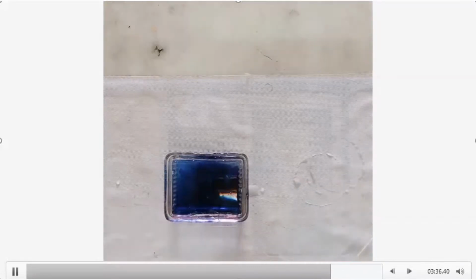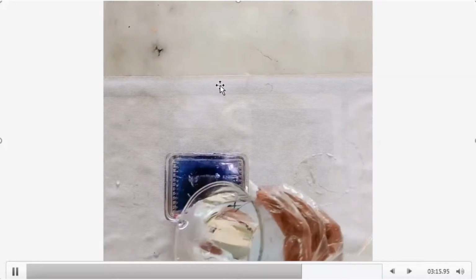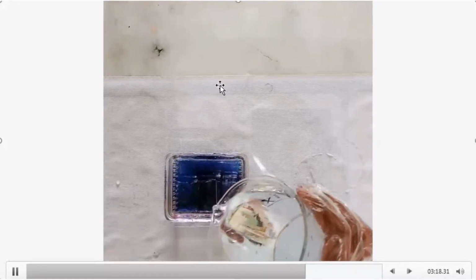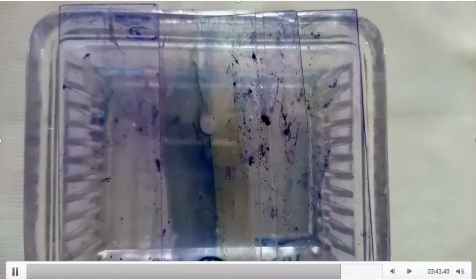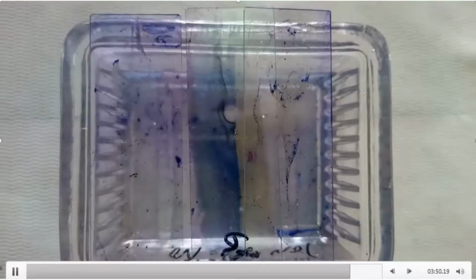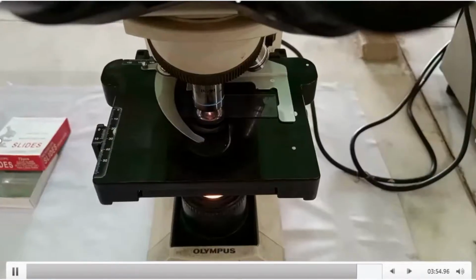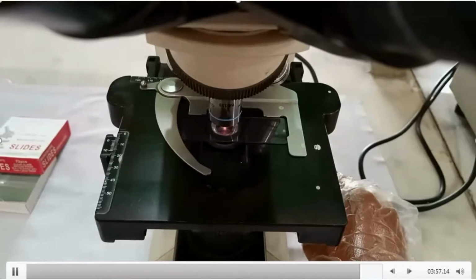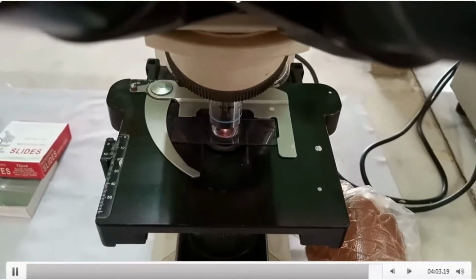Now we are going to wash them under the tap also. After washing, we are going to keep them in a vertical manner in order to dry them. And now we can see these slides left for drying. Now we are going to see them under the microscope under the oil immersion objective by using oil.